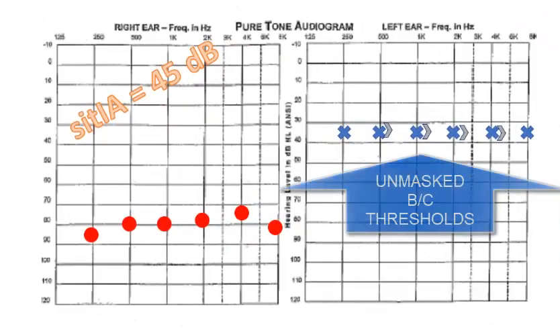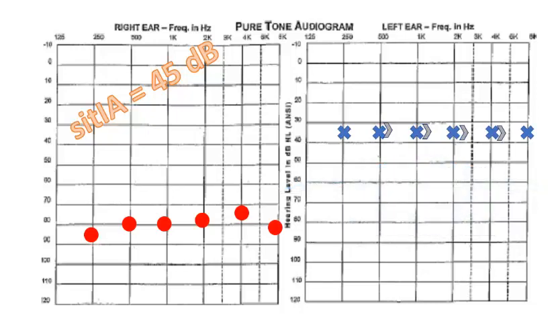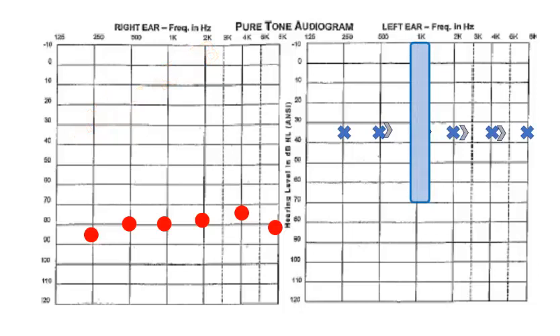What about this situation, where the left ear has a sensory neural hearing loss? At 1000 Hz, for example, we no longer have an 80 dB SIT-IA value. We have a SIT-IA value of 45 dB. Does that mean we can't start with 70 dB of masking noise? The answer is we can still start with a 70 dB level, even if the SIT-IA situation is 45 dB. In a worst case scenario, it means that 25 dB of narrowband noise may cross to the right side. That's a lot of potential masking crossover.